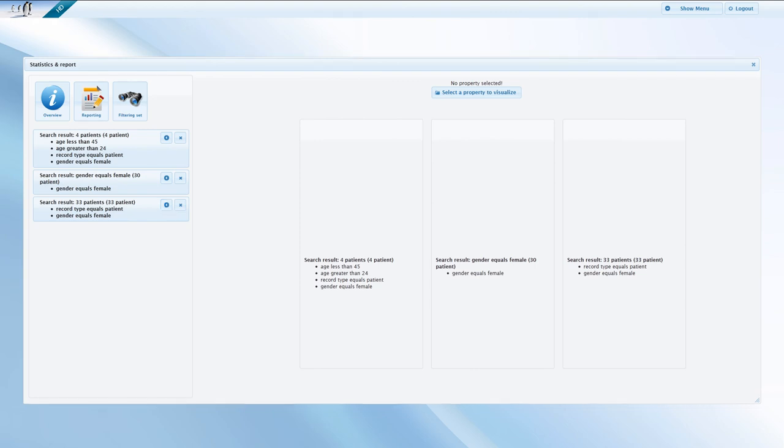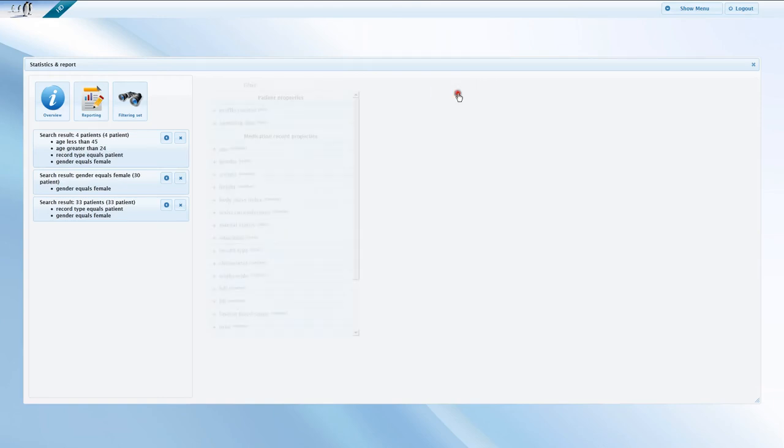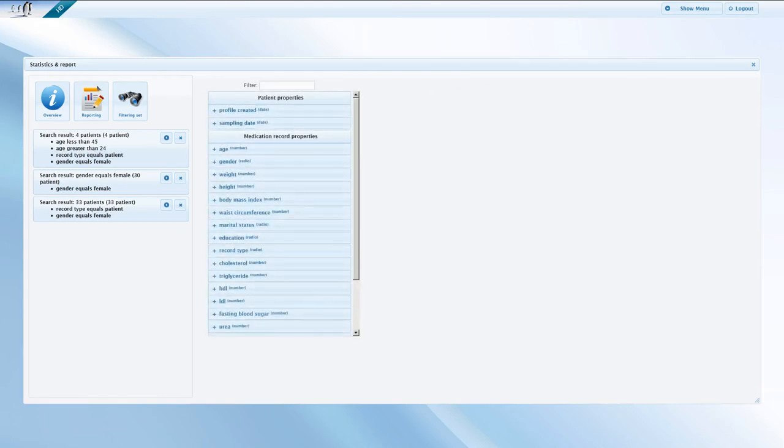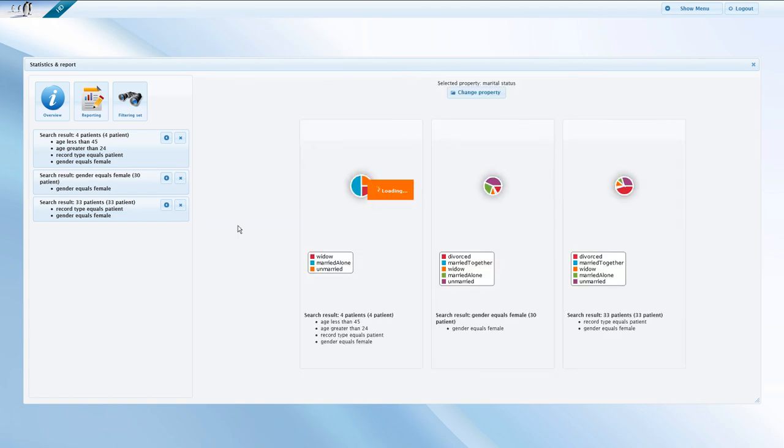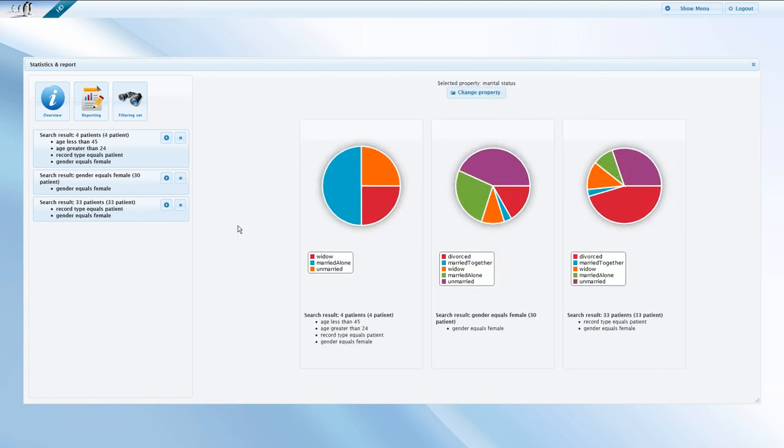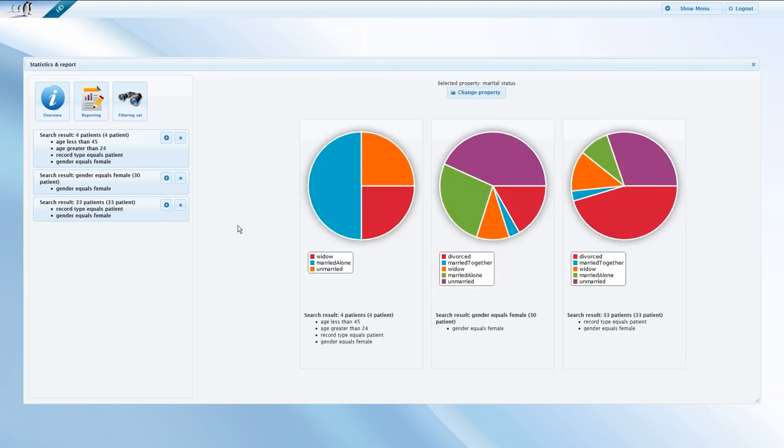To select a property for visualization, click the button on the top of the screen. In the demo, we examine marital status as a property in relation to the previously selected criteria. The chart shows the distribution of the previously defined segment along marital status. While pie charts are convenient to display results consisting of discrete numbers, there are also several continual values stored in the biobank.